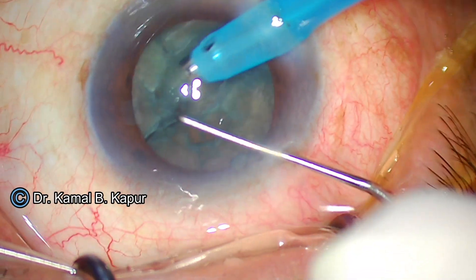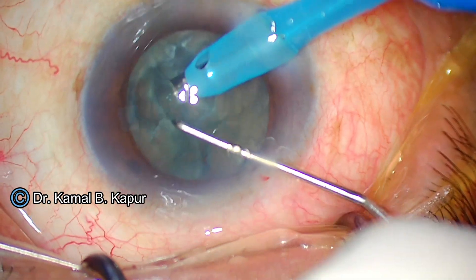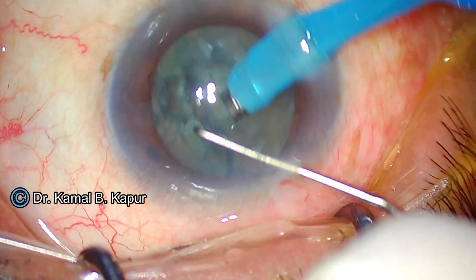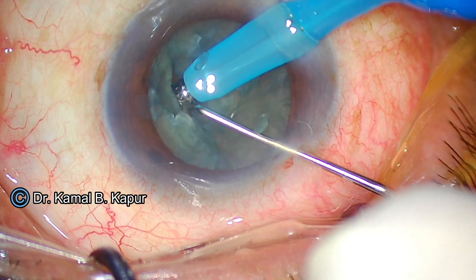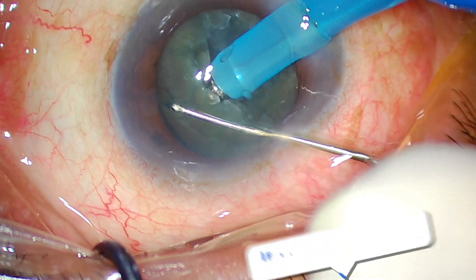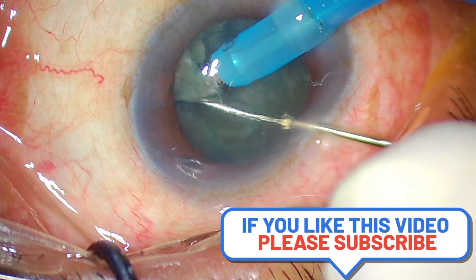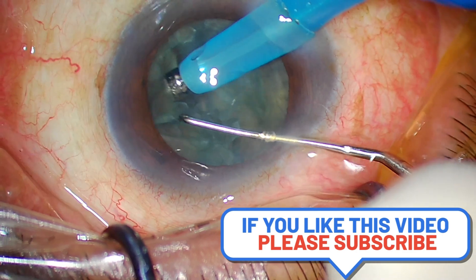Repeating the technique: always embed in the meat of the nucleus at least 50% depth, with a little burst of phaco since it is a soft cataract. Engage, pull the piece outwards, embed downwards, come towards your phaco tip, and separate. We now have four quadrants.